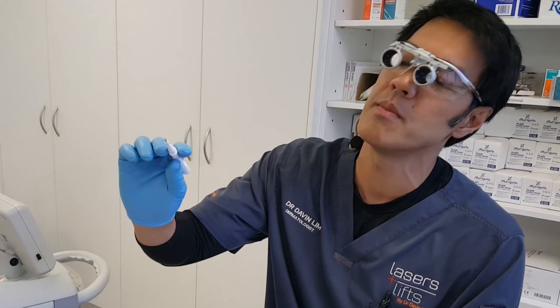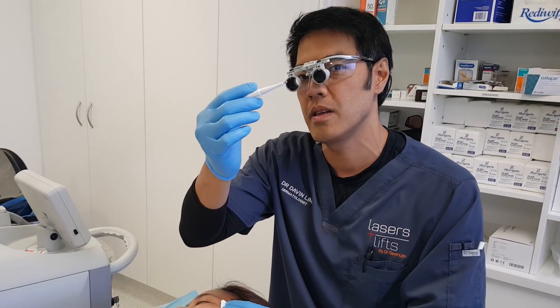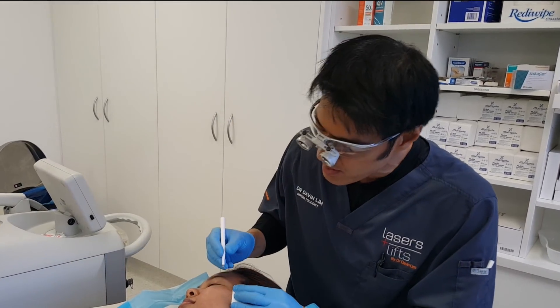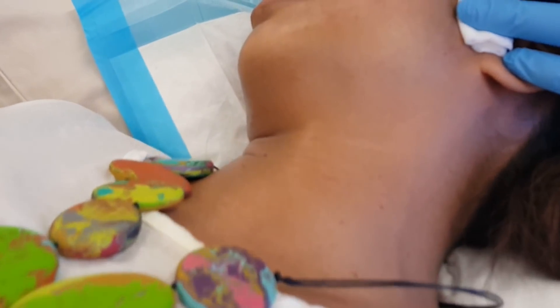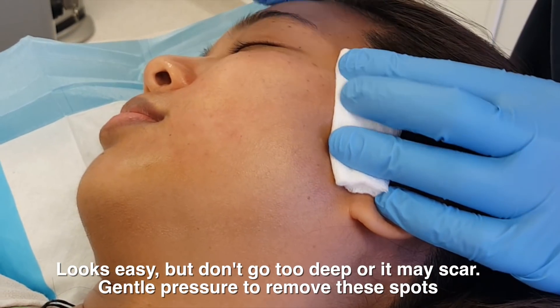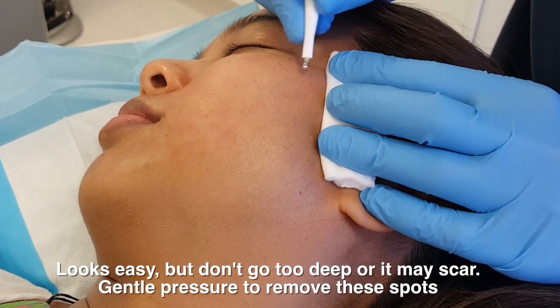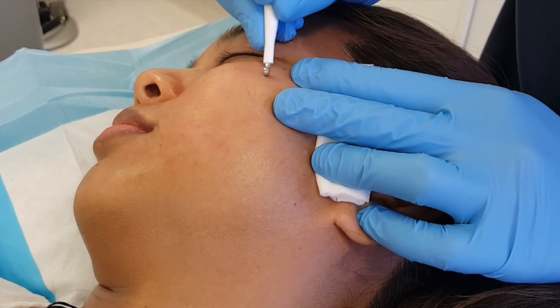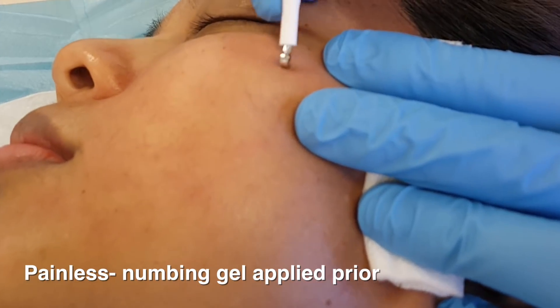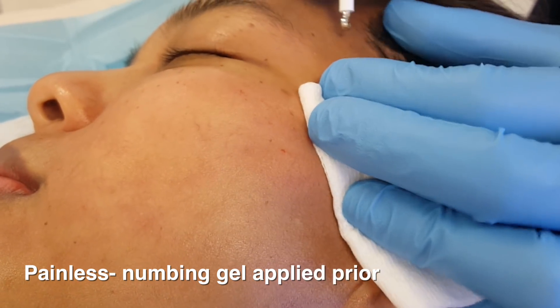I'll show you how I remove these using a curette — a very simple instrument. I can use a dull or a sharp one; this one is a dulled-up sharp one. I'll use it in a gentle manner just to lift off the warts — and it's gone. See how easy that is? You've got to apply just the right amount of pressure.